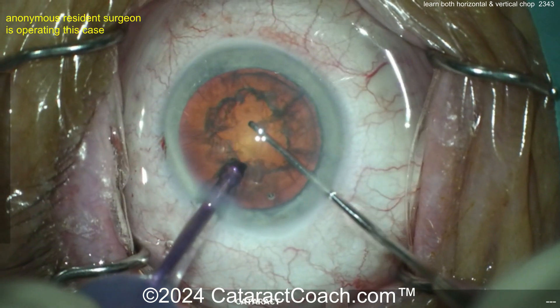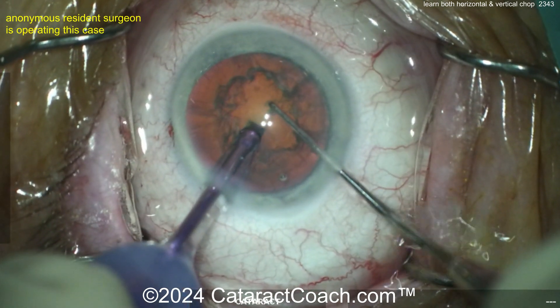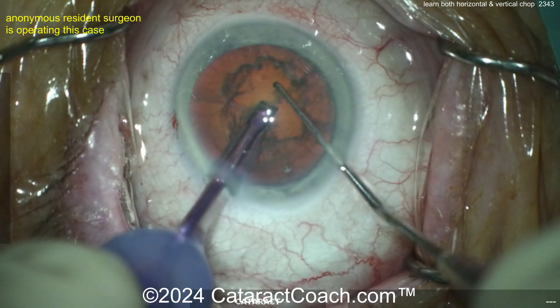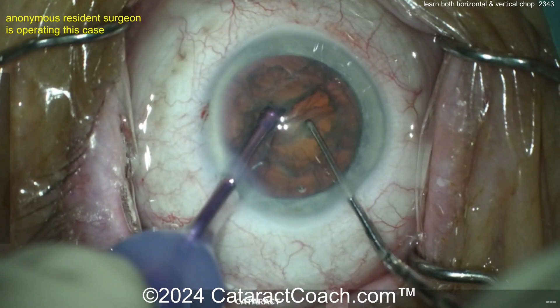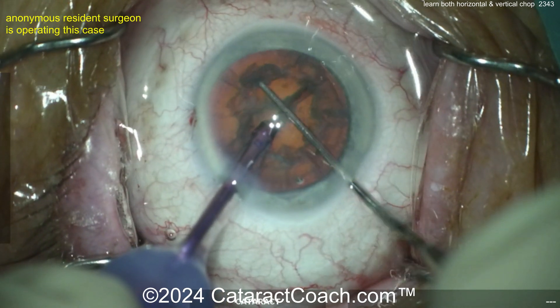Now here, the next case is going to be a vertical chop. Embed the FACO probe — I like its position, very nice. The chopper is just going to go straight down, right there, within the capsulorhexis even, and then just pull apart. You can see why the vertical chop is kind of nice, because you don't have to place the chopper underneath the capsulorhexis edge.